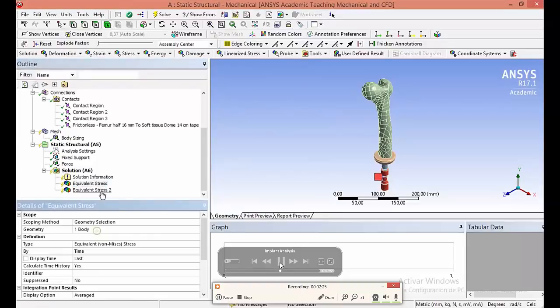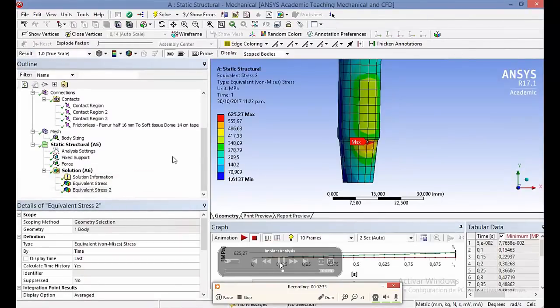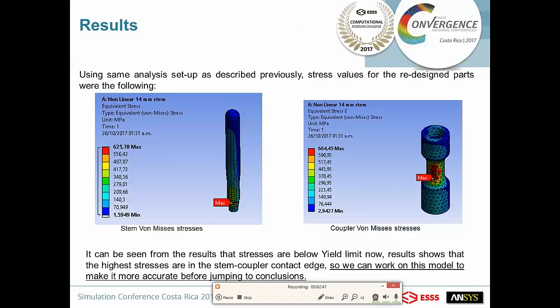So we did the analysis again, we solved, and we got the following results with the redesign. So what we have here is that now the stem has lower stress, and also the coupler. So these results are really good. In there we can see that we have 625 megapascals for the stem and 664 for the coupler, which both are way lower than the yield strength that we talked about before, that is about 780 and 90 megapascals.